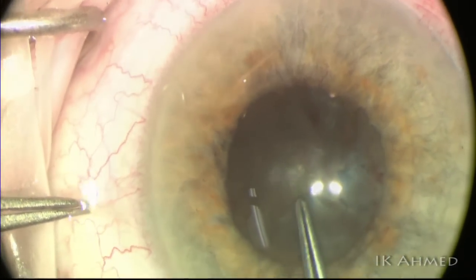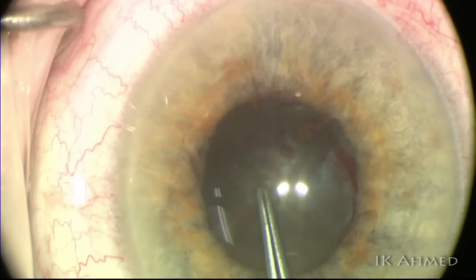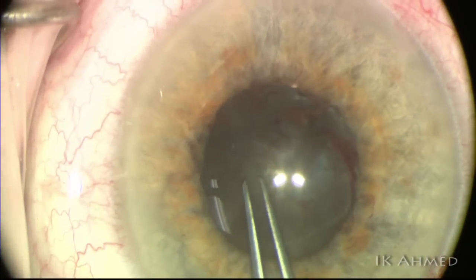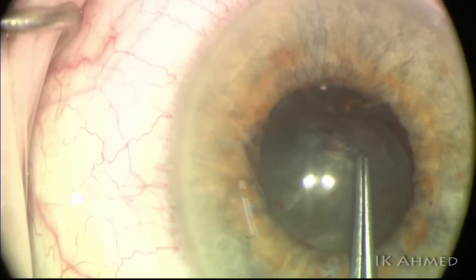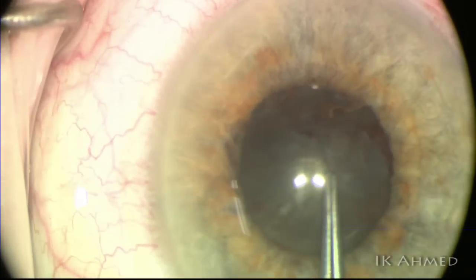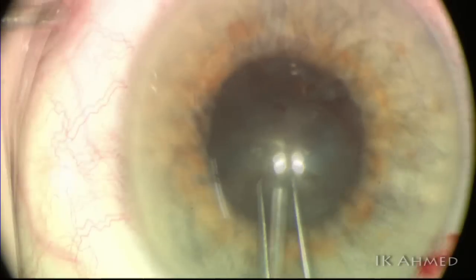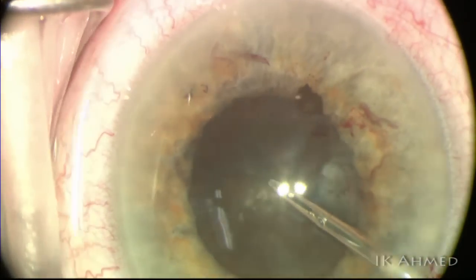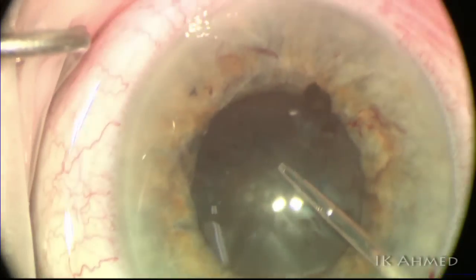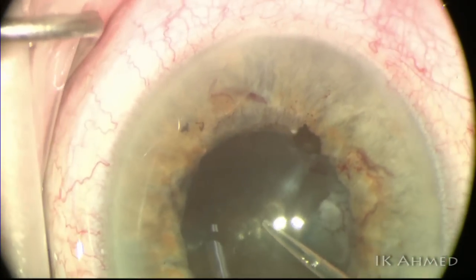You can see there is underlying capsule still present — the majority of the anterior capsule is still present and has not been adequately incised yet. This is a challenge, and one of the issues we often encounter in these very dense cataracts: a capsular splitting phenomenon whereby a superficial layer is initiated first and then breaks off.